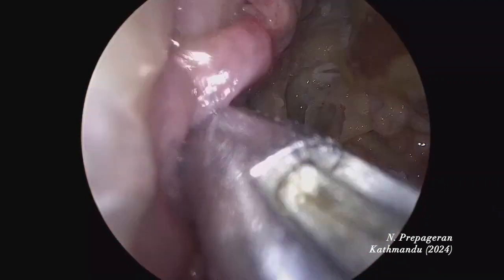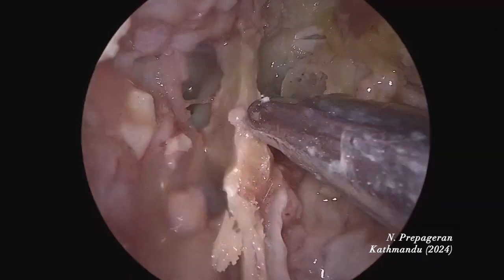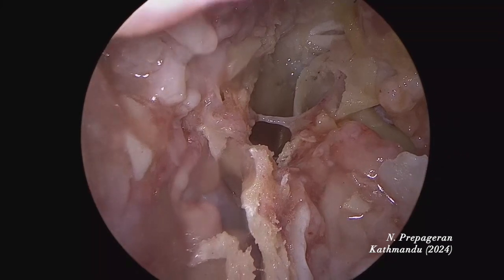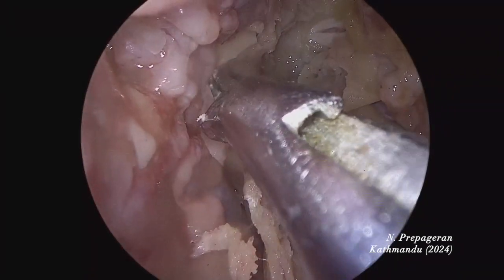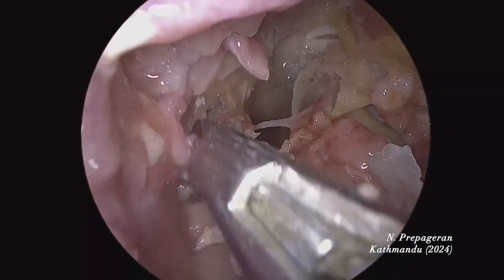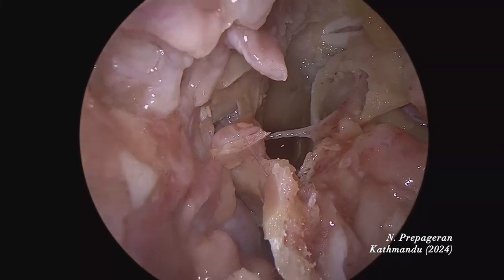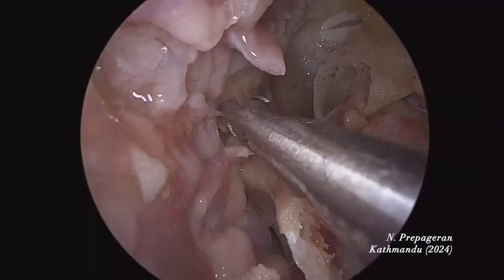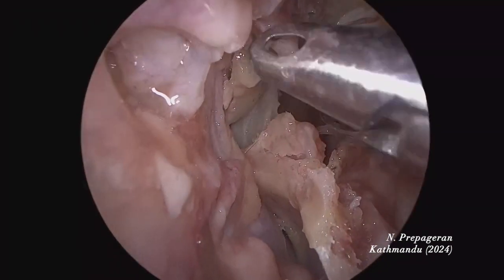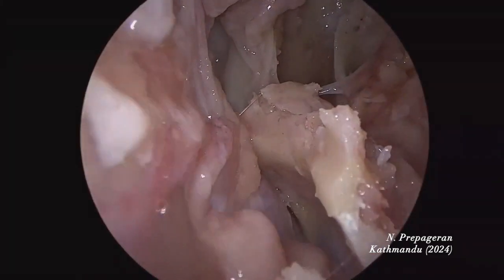Once you've done that, you've exposed both sides. You can actually just break it after you have done enough osteotomies on both sides. Now we are inside the sphenoid sinus. If we have a well-pneumatized sphenoid sinus, the dissection will be easy. If it's not so pneumatized, it won't be as easy — but either way, we will always manage.